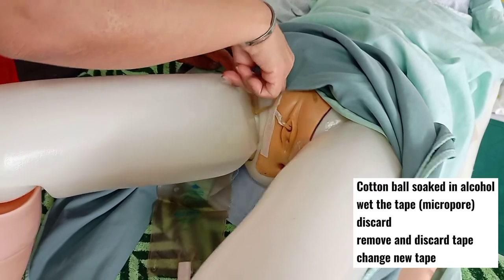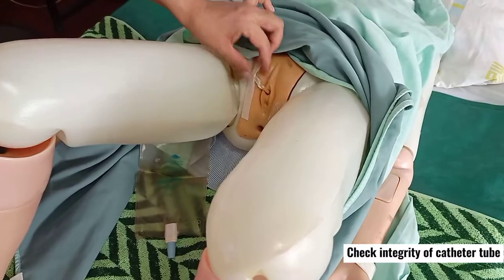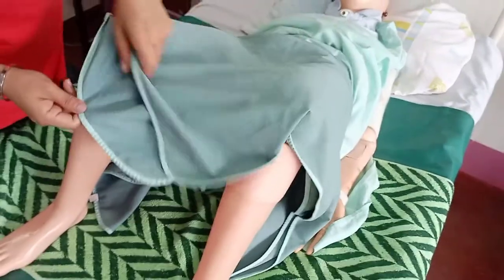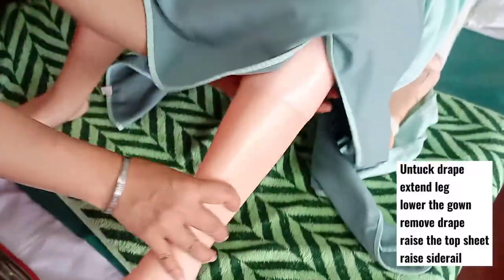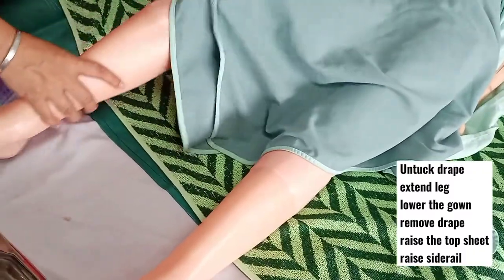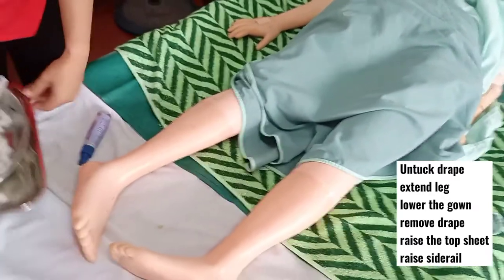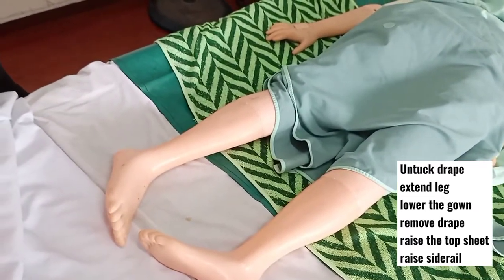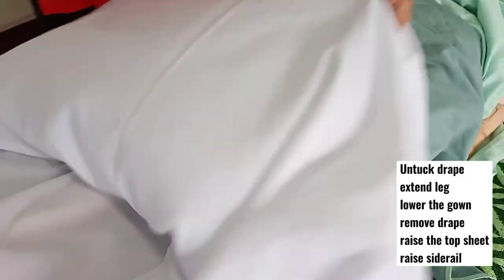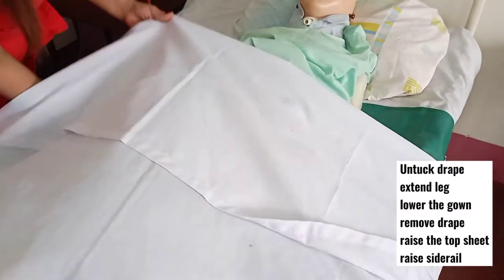Check again the integrity of your tube, then untuck the diamond drape. Set aside all the materials, raise the top sheet, and remove the diamond drape.